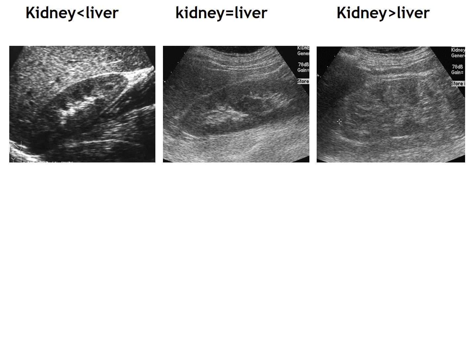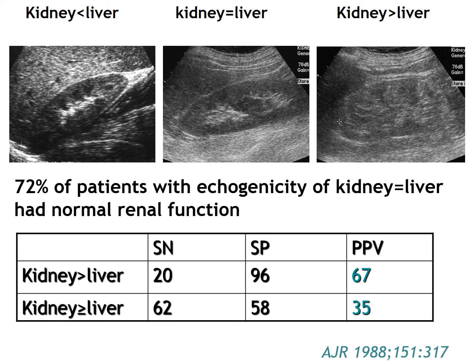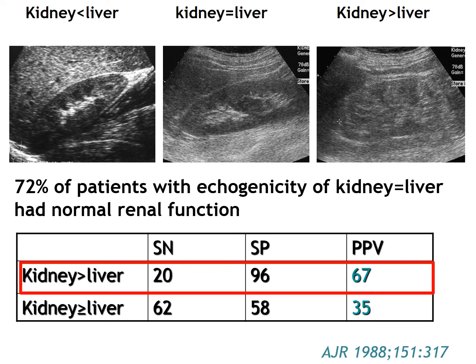Looking at grayscale ultrasound images of three different kidneys: the first has renal cortical echo lower than liver echo, the second has the same echogenicity as liver, and the third has cortical echo higher than liver echo. The left side is clearly normal, the right side is clearly abnormal, but the middle image is difficult to classify. An important paper demonstrates that we should consider renal cortical echo abnormal only when it is higher than liver echo, since this criterion yields higher specificity and higher positive predictive value.